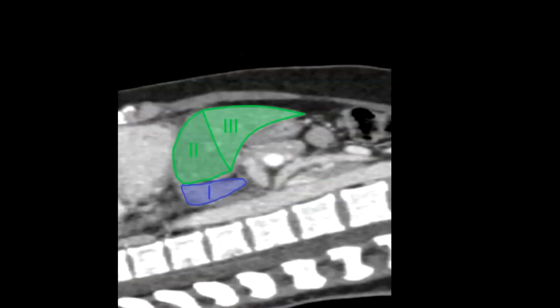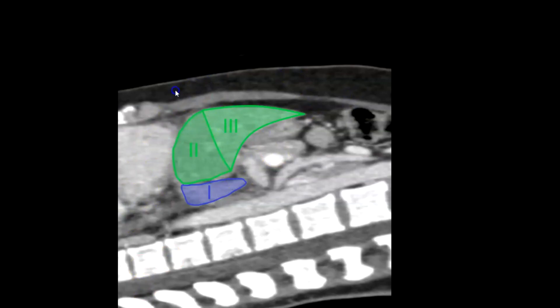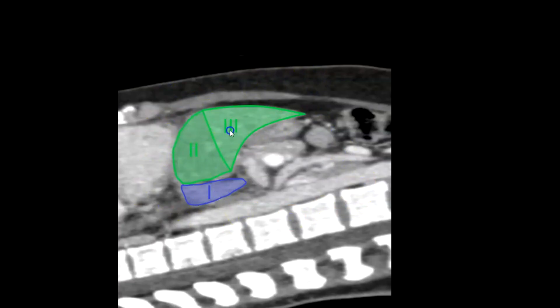Now for some CT views. In sagittal CT — I've rotated it so the ultrasound probe orientation is represented — you'll be seeing segments 3, 2, and 1 (caudate lobe): the superior and inferior segments of the left lobe.